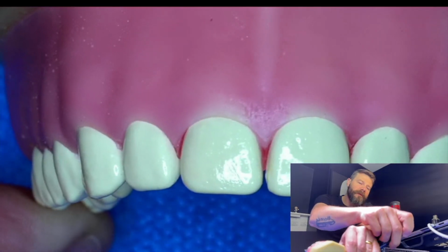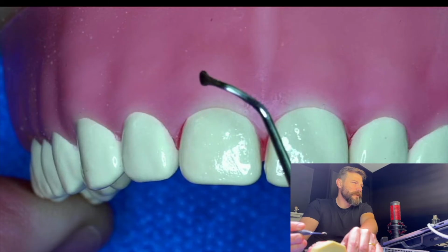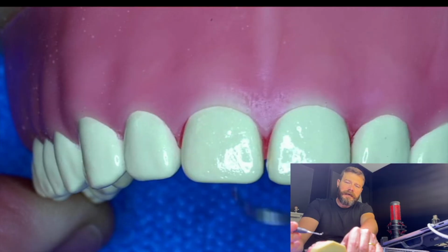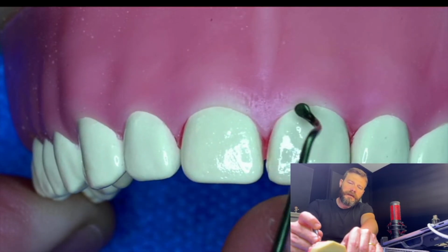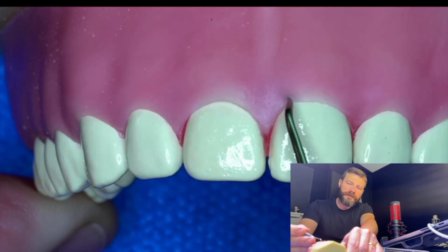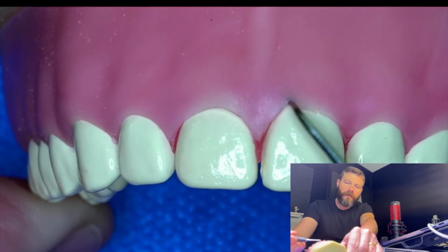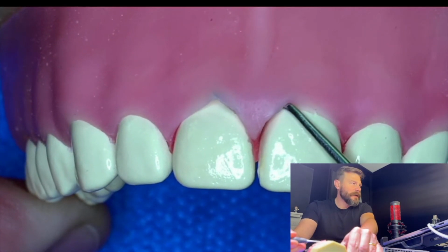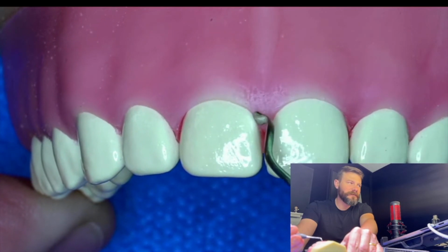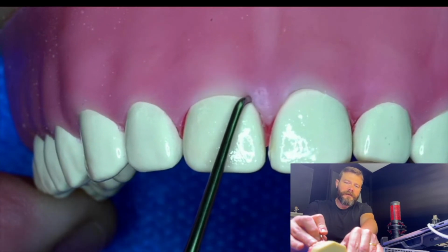The one we were previously talking about, the papilla elevator, is exactly this instrument here. You see a very weird curvature, but this instrument was designed exactly to go inside the sulcular area without stretching the sulcus, and with a small leverage movement I can detach the whole papilla until the next crown. So I can be active here without any stress on the papilla, and the curvature allows me to go to both sides, no problem.